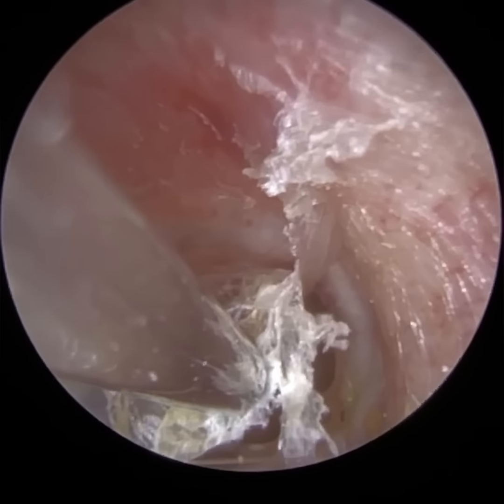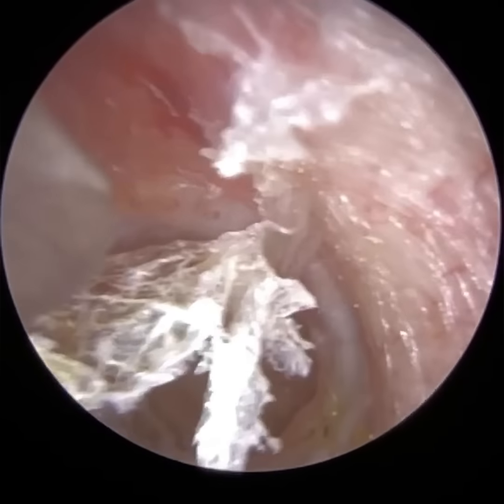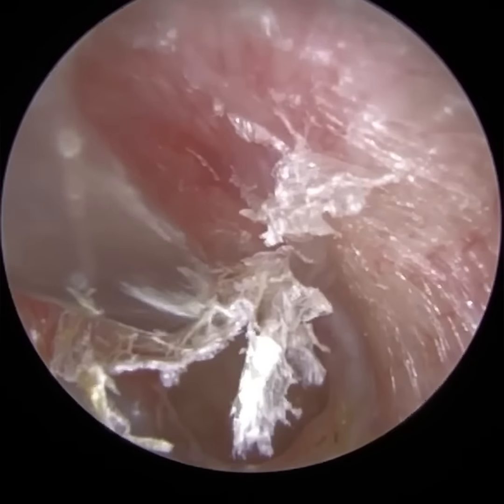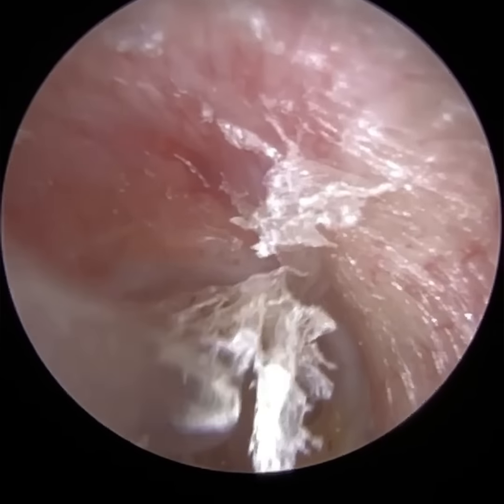And you can sometimes see the round window in a patient with an intact eardrum, so there's no hole. If they've got a very translucent eardrum, you can actually visualize it. But here we could really see it.